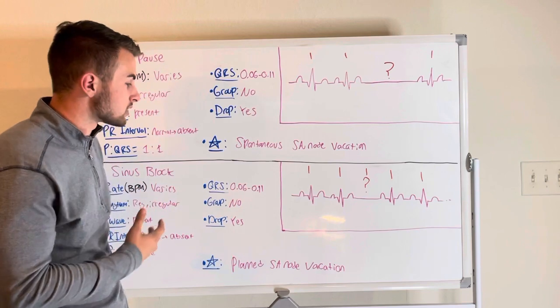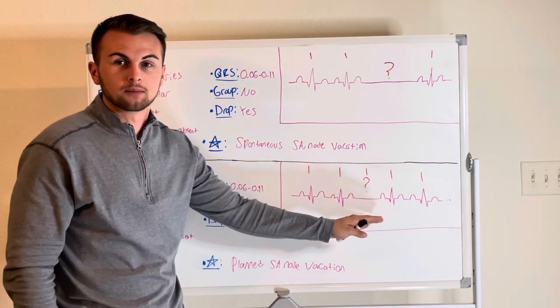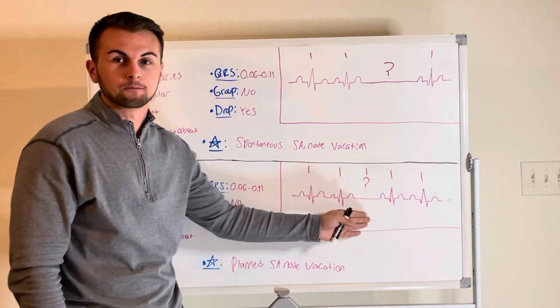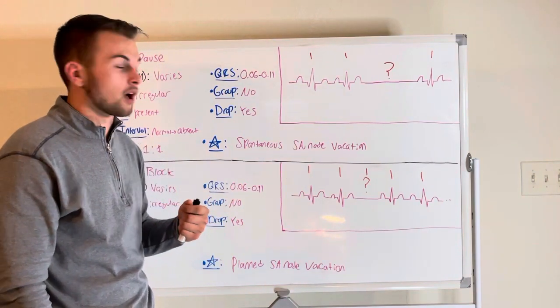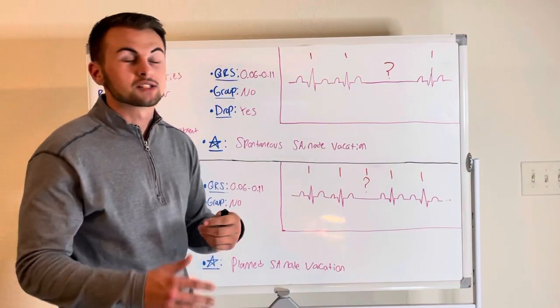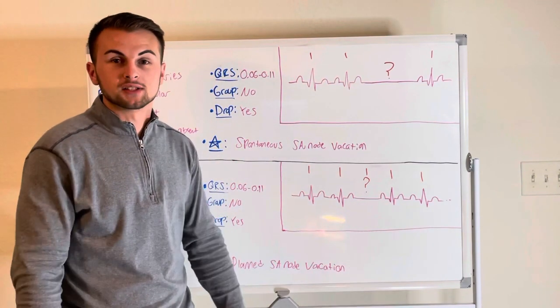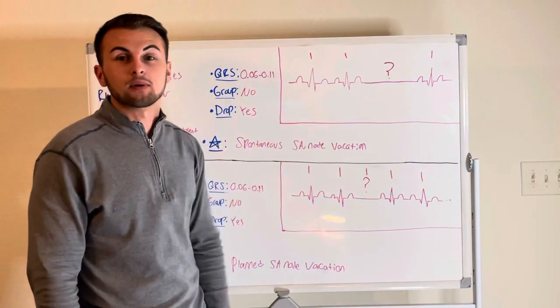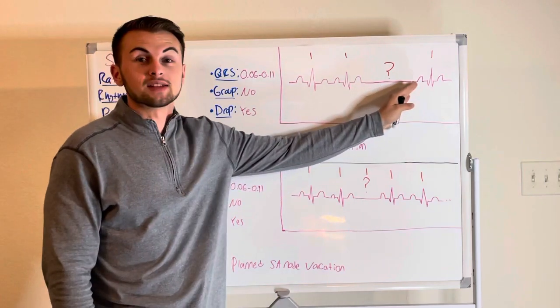So now we're going to take a close look at the rhythm called sinus block or sinoatrial block. So basically, the SA block is just a predictable beat drop. So this is normal sinus rhythm with a predictable beat drop. We have heard the DJ Sinus Block song before. We know exactly when DJ Sinus Block is going to drop a beat on us. It's very boring. It's way more boring than DJ Sinus Pause. Remember, DJ Sinus Pause is going to make us wait in suspense, right?